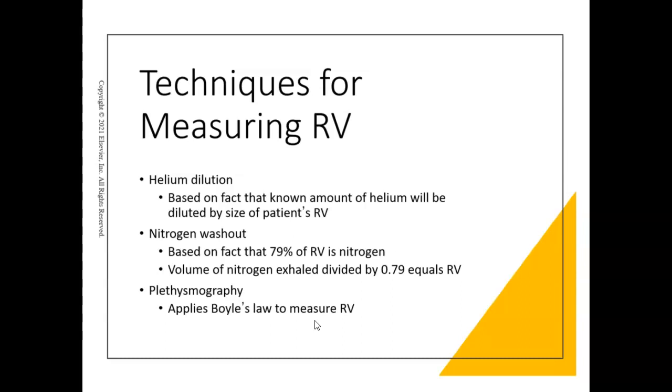The significant thing to know is that this is the best way of obtaining an RV, through plethysmography, because it measures that entire chest volume.